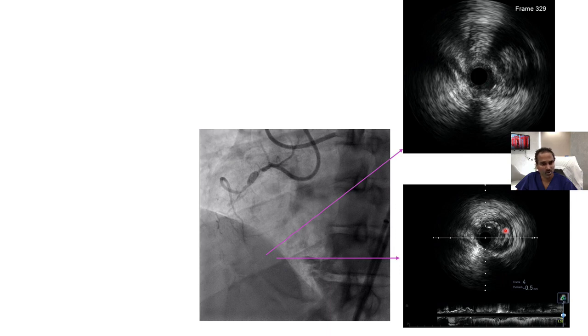Which showed I am in subintimal space immediately before the crux. So though I knuckled from here, my course was subintimal up to here. That means my retrograde wire escalation to Gaia 2 actually went through subintimal from here, immediately prior to the crux. So in the entire area I am in subintimal space.